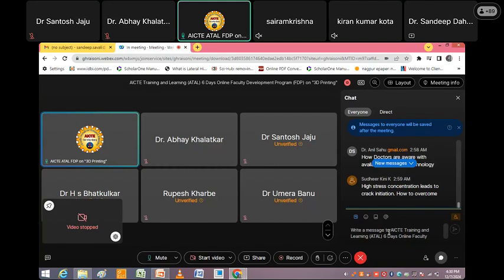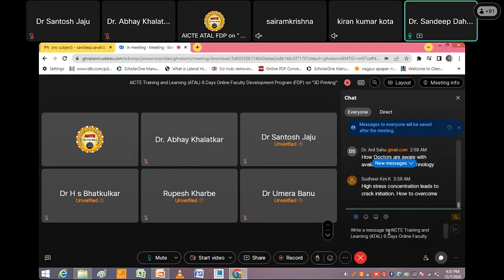So you can go with rapid prototyping technology for the customization of different implants and different surgical guides, not only specifically for mandible surgery that I have told you about, but in the previous lecture I showed you around 12 different surgeries where this type of custom surgical guide is useful. Whatever designs I showed you in the previous class, you need not finalize only that design. You are free to design by yourself as per the requirement of the surgeon. So this flexibility is there.